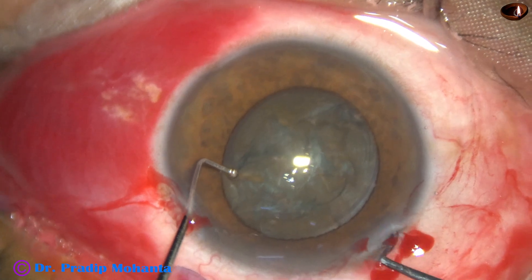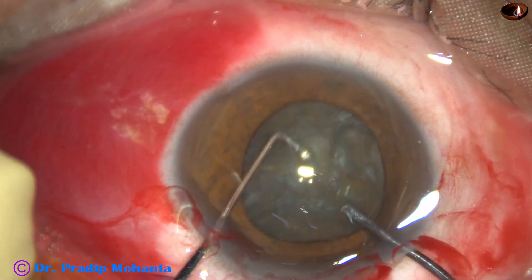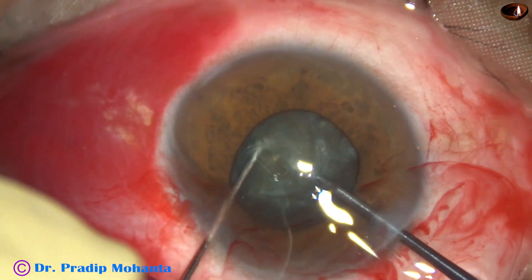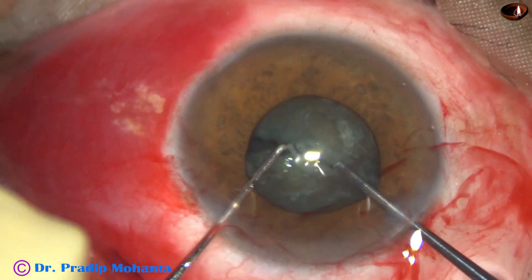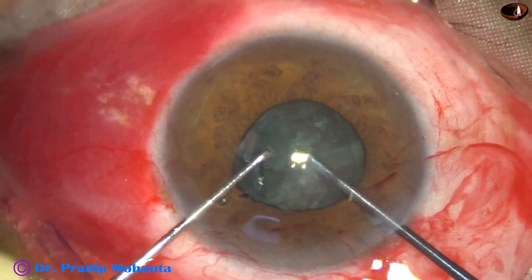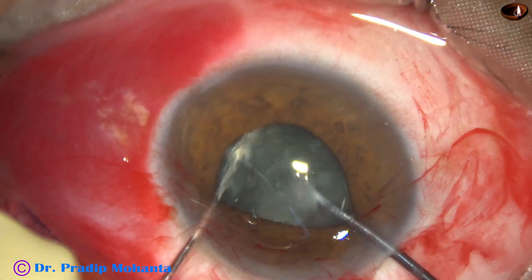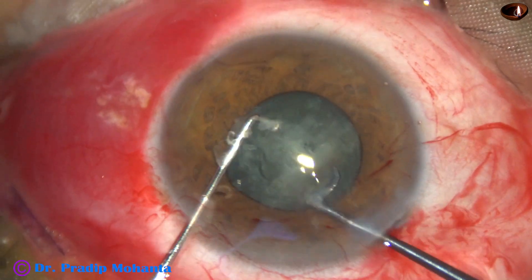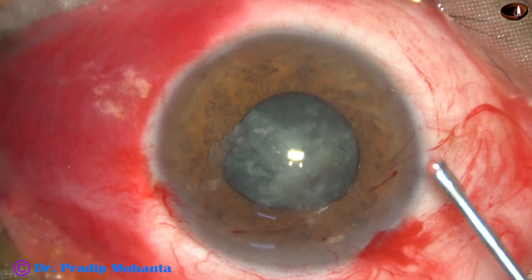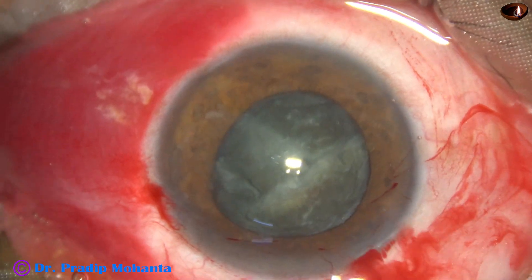This is the pre-chopper and sustainer, and I divide the nucleus into two hemi-nuclei. Rotate and divide one hemi-nucleus into two fragments. A lot of visco has come out.